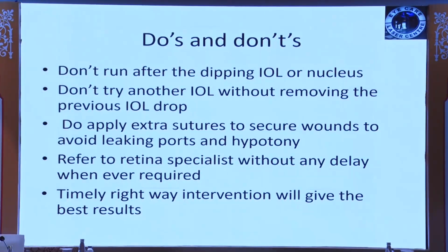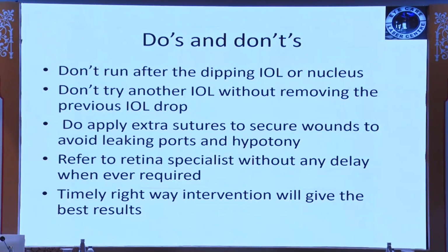Don't run after a dipping IOL. Don't try another IOL without removing the previous IOL. Do apply extra suture to secure the wound to avoid leakage, port leak and hypotony. Refer to a retina specialist without any delay once the lens has fallen back. Timely, right way intervention will give the best results.